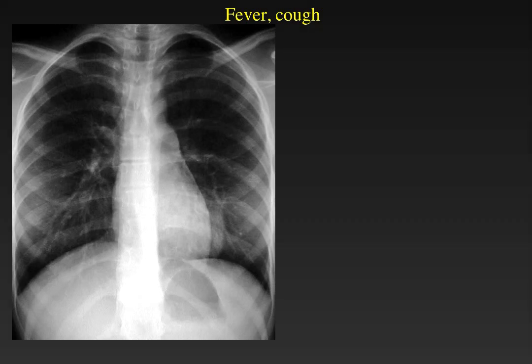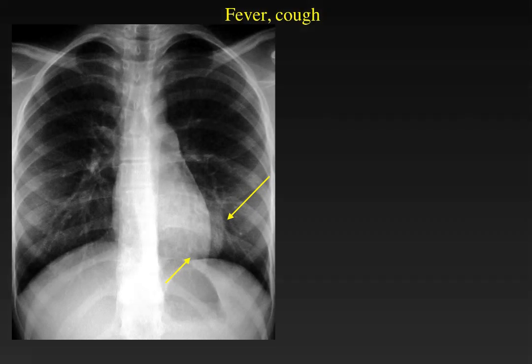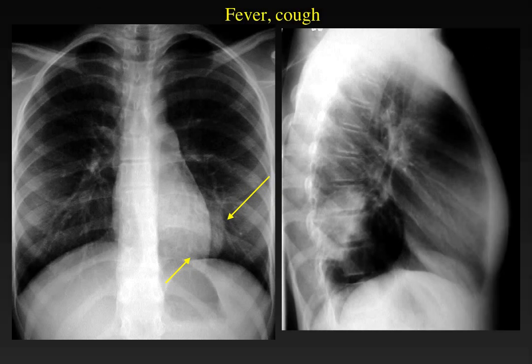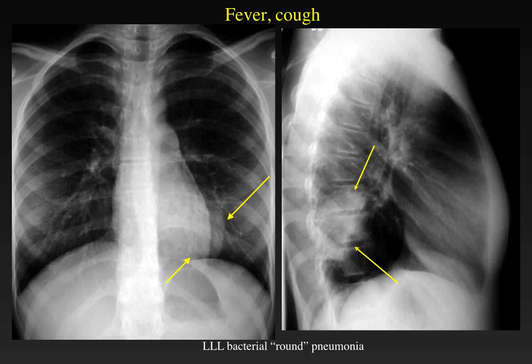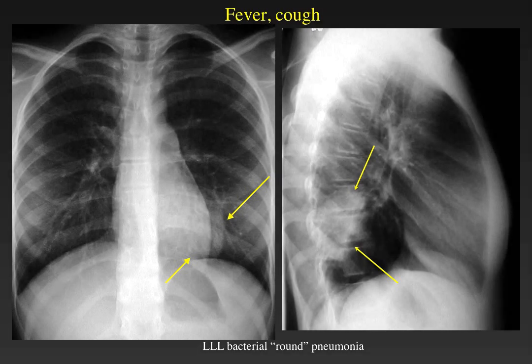When we see a focal parenchymal change in density, we have to consider the possibility of pneumonia, as in this child where there is a dense, well-defined, rounded mass in the retrocardiac region. On the lateral view, we can see that this mass is overlying the spine. This is a round pneumonia, which is a classic sign for bacterial pneumonia in children. Pneumonias tend to be well-defined and rounded much more commonly in children than in adults, and they may be misinterpreted as a pulmonary mass.